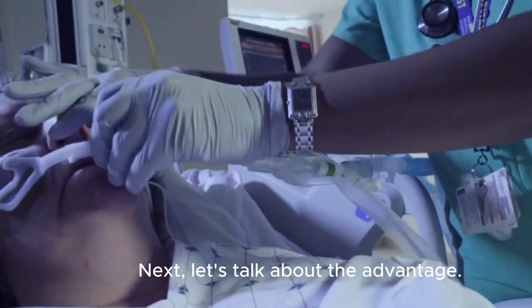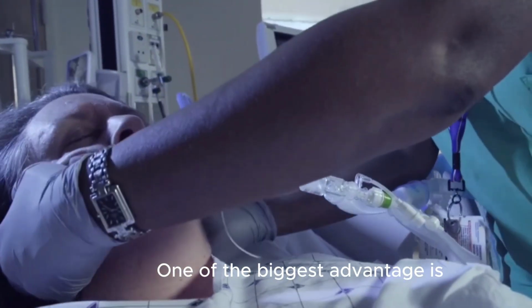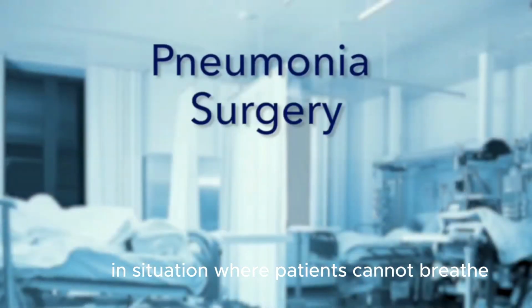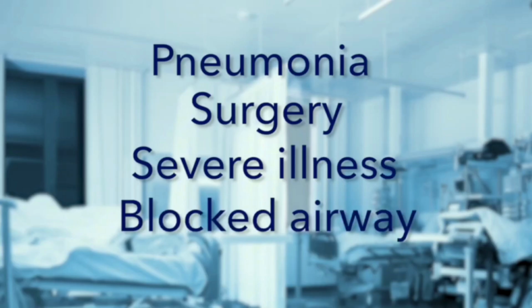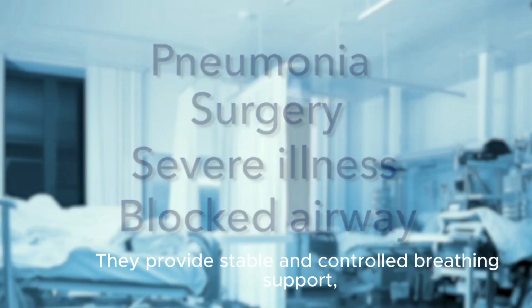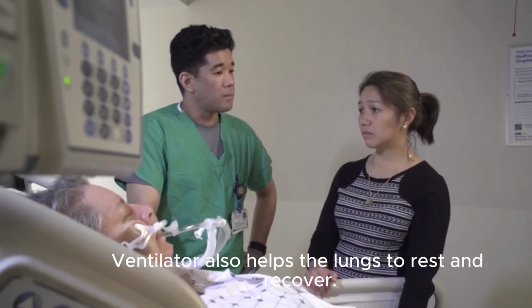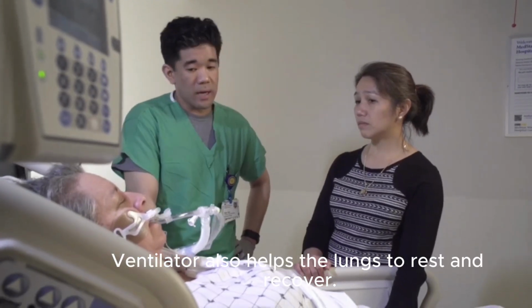Next, let's talk about the advantages. One of the biggest advantages is that the ventilator saves lives in situations where patients cannot breathe on their own. They provide stable and controlled breathing support, which can make it easier for doctors and nurses to give other treatment. Ventilators also help the lungs to rest and recover.